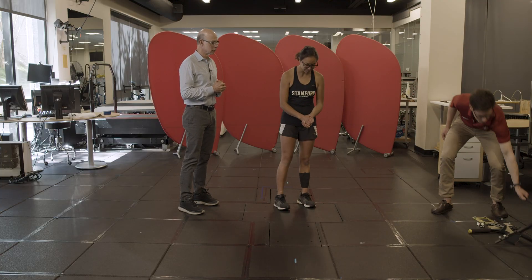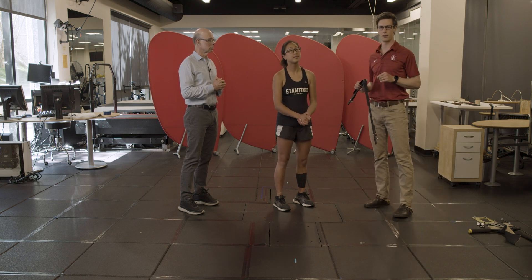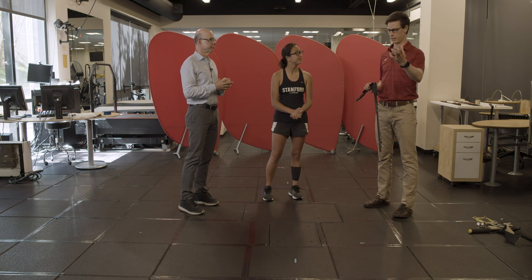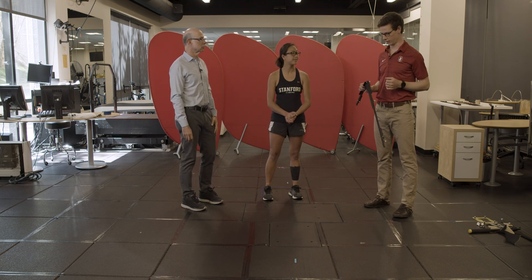The first step before we start any motion capture experiment is calibrating our space. The cameras around the top of the room need to know where they are relative to our force plates, and they also need to know where they are relative to one another.